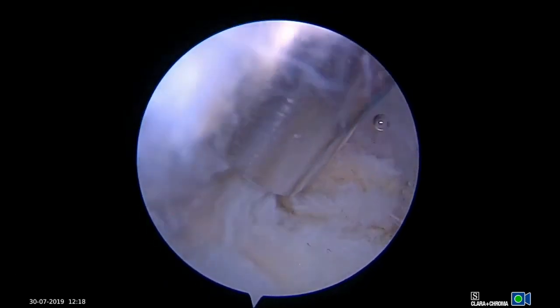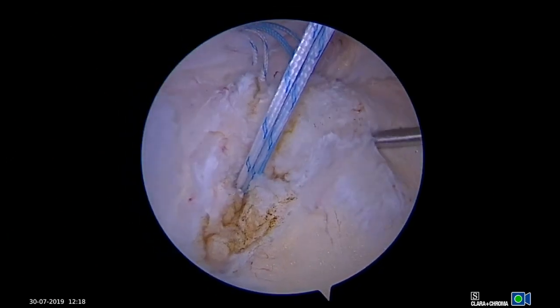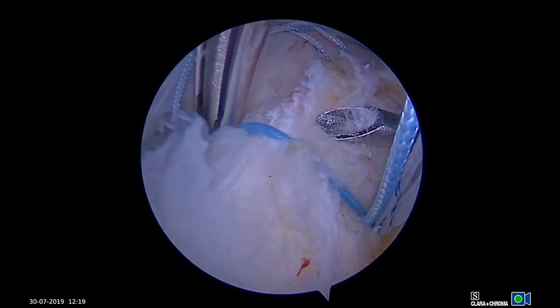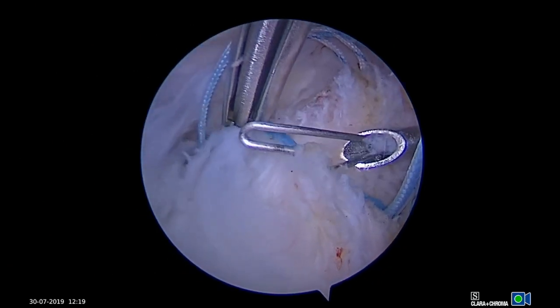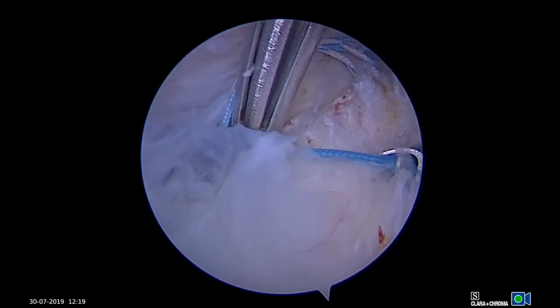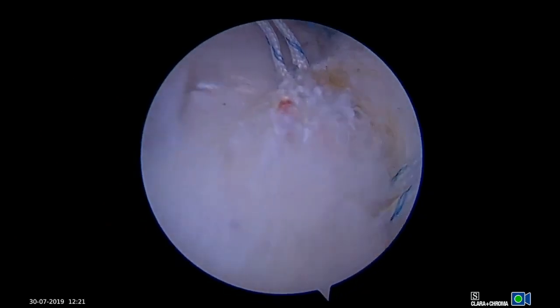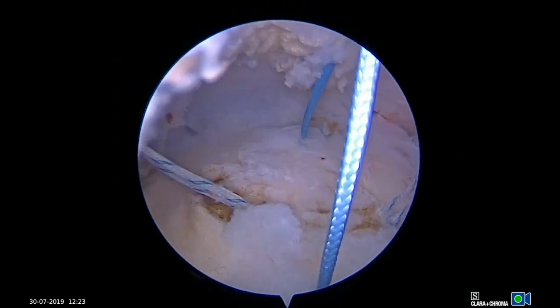The arthroscope is then moved to the lateral portal. Suture retrievers pass through the anterior portal to place suture through the anterior leaflet, and through the posterior portal to place suture through the posterior leaflet, creating a mattress suture. Usually only a single mattress suture is needed to close the defect, but both sutures can be used if necessary.